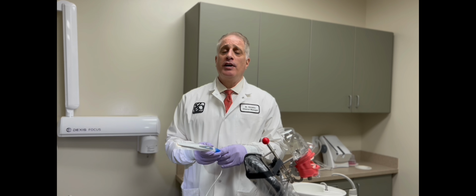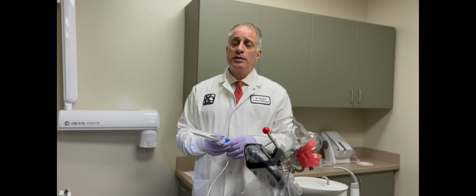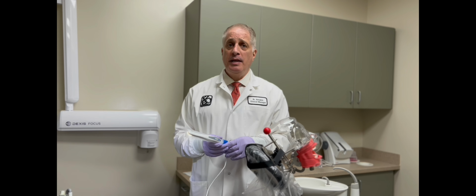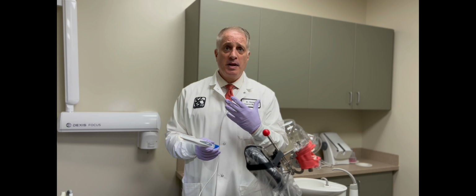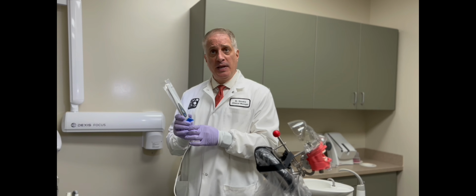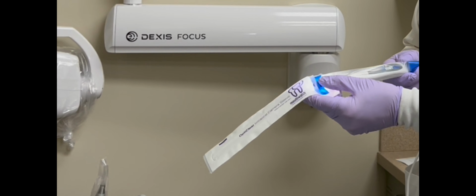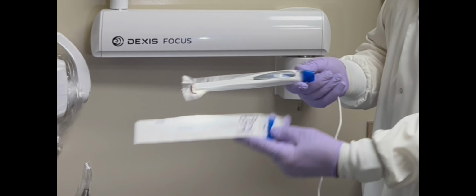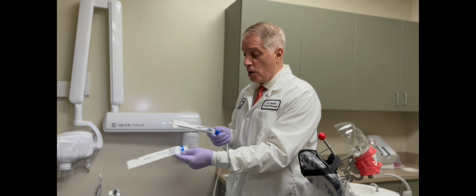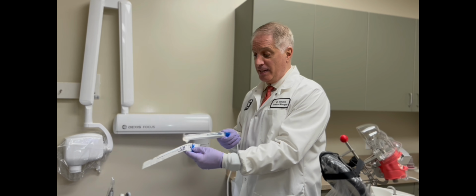Now we're going to demonstrate how to use the intraoral camera on a patient. First and foremost, and most important, is proper PPE at all times. Please forgive me, I'm not using a mask for this demonstration. In addition, speaking of PPE, you'll need to insert the camera into a barrier sleeve, making sure that the logo and the blue bar are inserted in this manner.